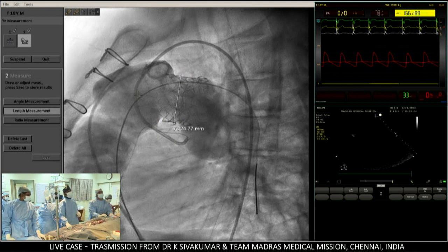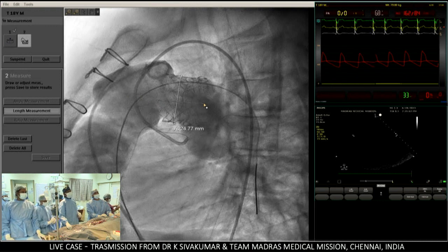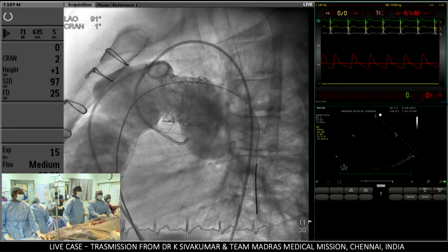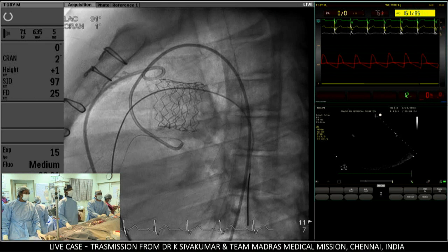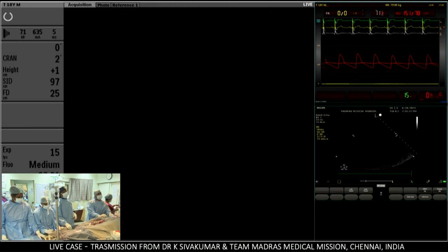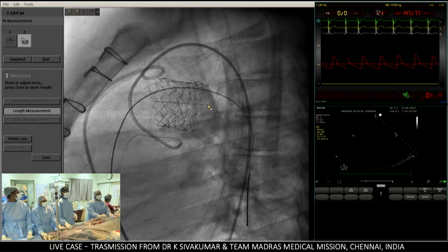I wanted length as well. Yeah, correct. Go further, without the contrast. Save it, go back. Empty the contrast. Correct, freeze it. That's the one. Now you measure only the diameter and the length. Just take it, correct. Go a little beyond. Okay, not so much.